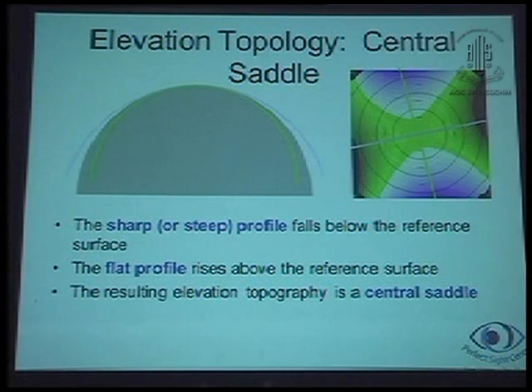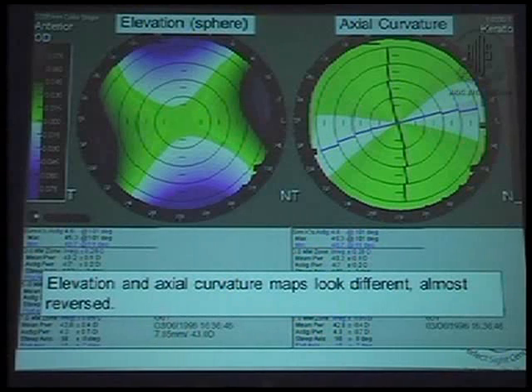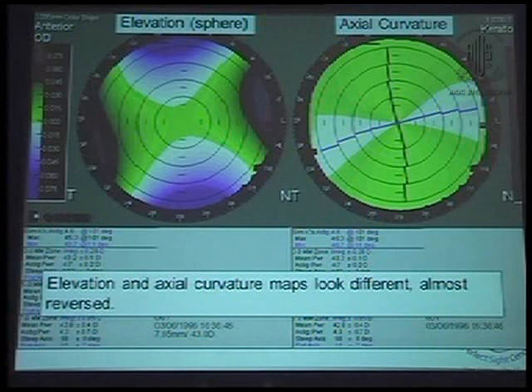Let's contrast it with the regular, Placido based topography. This is your Placido based topography. The same cornea, this is the steeper axis we know. The red is the steeper axis. This is how it would appear. The colors are like this, the warmer colors towards the steeper. But here we just saw that in the steeper axis the periphery was going below, therefore it was represented blue. So therefore there is a sort of color reversal.